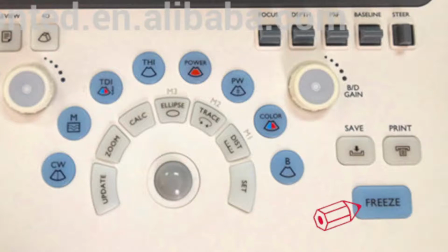Freeze freezes the image so you can save it. Save saves an image or a video. And on any machine you will find gain buttons that allow you to adjust the near and far gain of your picture to make it brighter or darker as you need.